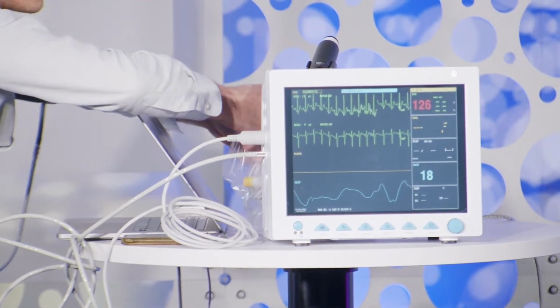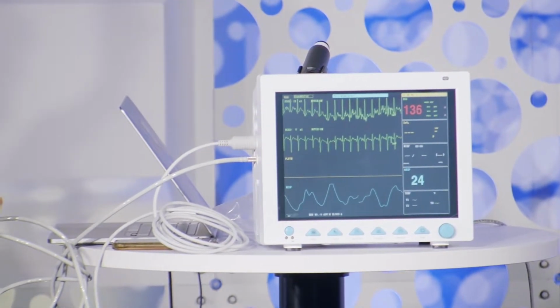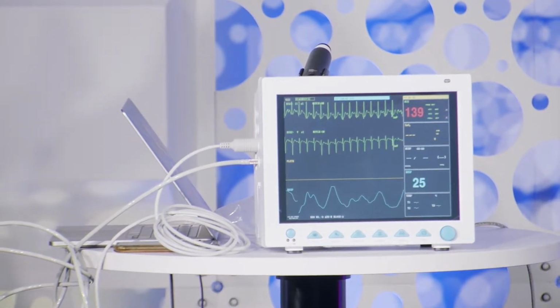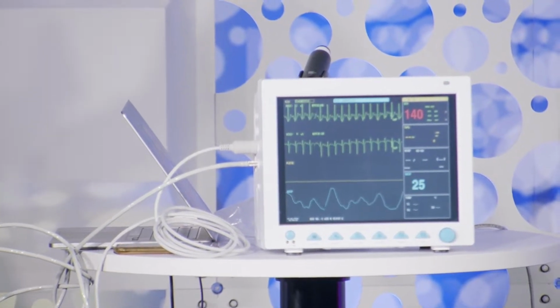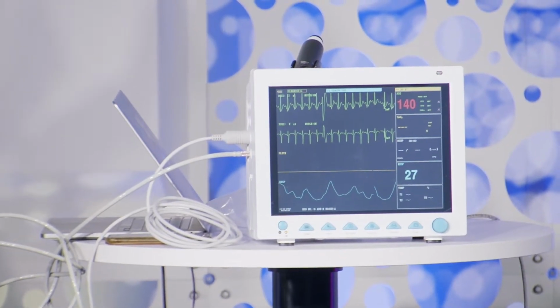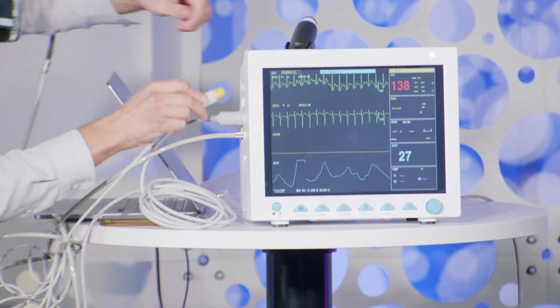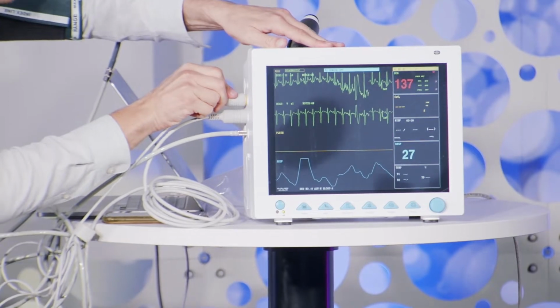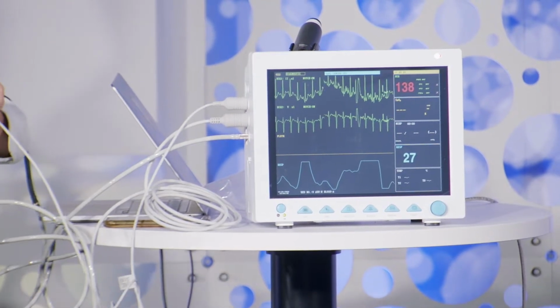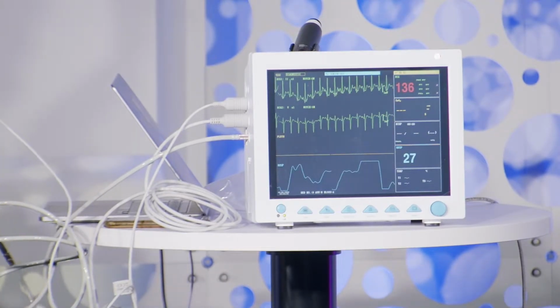In a nutshell, like in any other CPS, cyber physical system, we have a sensor. In this case, we can talk about the SpO2, the saturation, which reads data using a sensor and some physics. Somebody came up with a way to read it. A software piece interconnects and talks to that sensor, getting the data. That data is normalized in order to show it in a given range, and it's shown on the screen itself. This is the normal reading process.